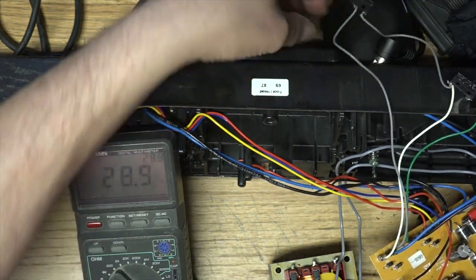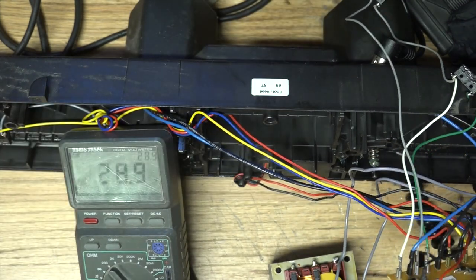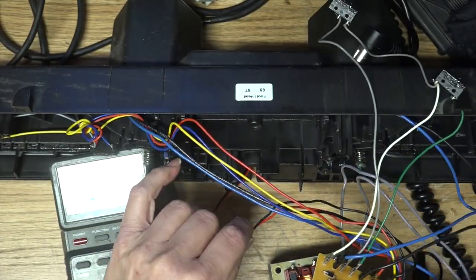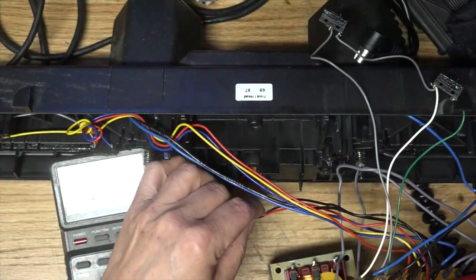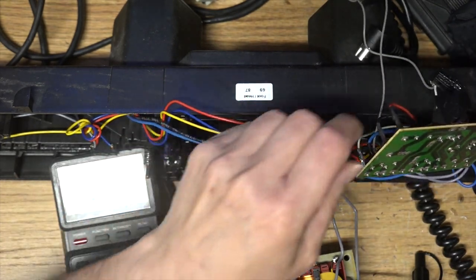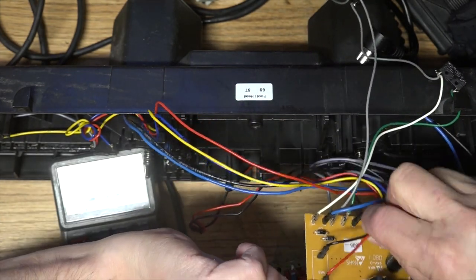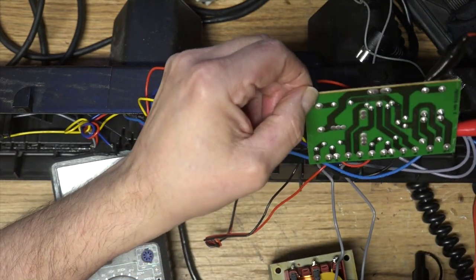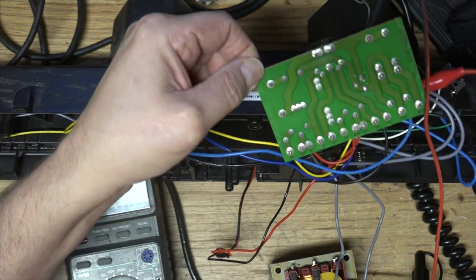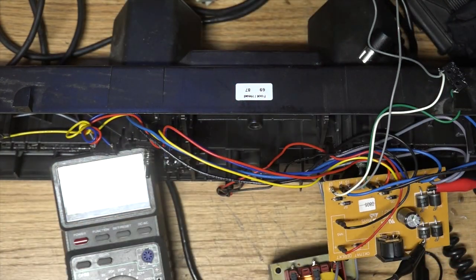And what was the 9 volt connector for back here then? Where'd that go? Yeah, so there's a 9 volt connector coming in here, so I'm wondering if the motors could run on something as low as 9 volts in limp mode if the power is out. Yes, and that's coming through a couple of diodes, probably to protect it from the current going back down to the 9 volt and making it pop. So, cool. All right. So let's take a look at those motors.